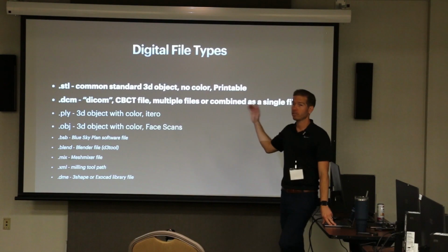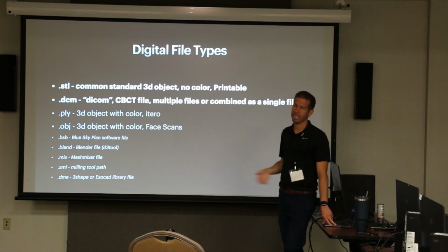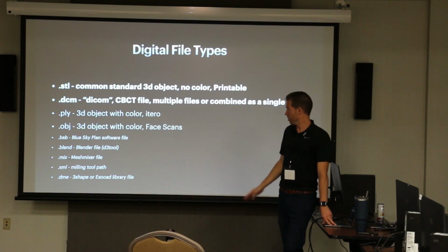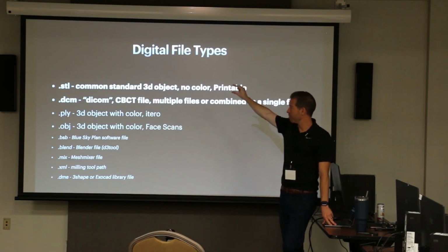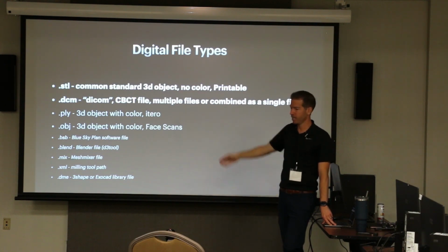Quick review, we've got to know our terminology. This is like our language of dentistry or digital dentistry. The only thing you really need to know is STL and DICOM. Those are the big important files to know. We don't do a lot of color scanning. I mean, the color doesn't really help us much in our world. But the important differentiation is, remember, it's got to be an STL or a DICOM, and it can't be one of these program-specific files. So that's just a basic thing you've got to understand.